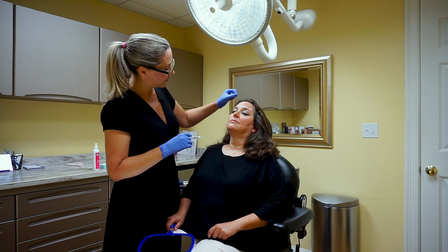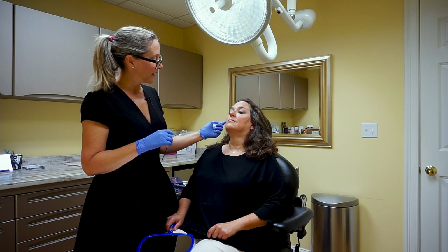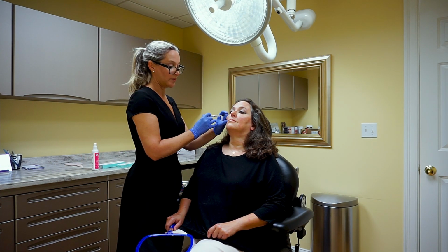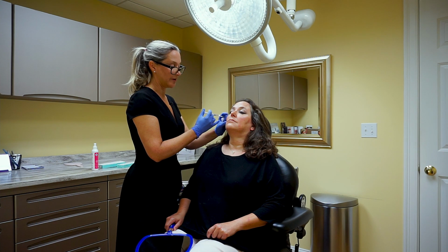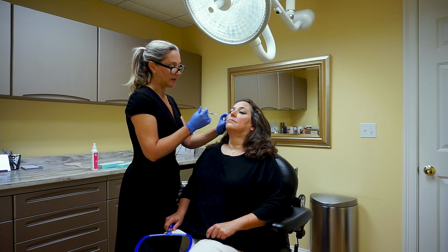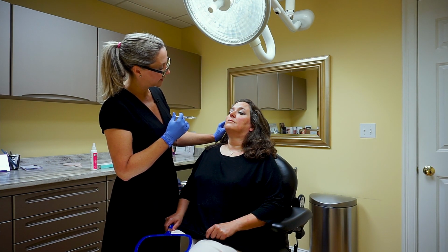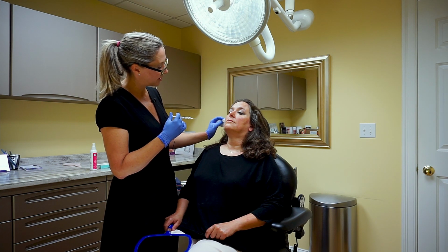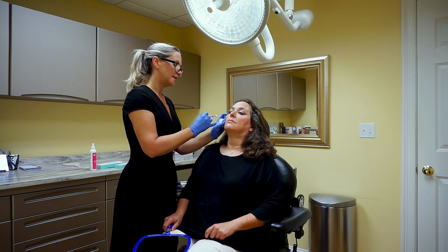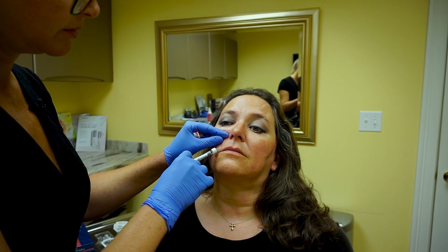But I've used about half a syringe, and you can see that we're starting to see an angular look here. You could take somebody who has a little more volume in their face, and actually by adding volume could make their face look thinner. And that's by balancing the way that you're injecting it and where you're putting it and the angles that you're creating and the shadows. So I'm creating a shadow out here. Gives me an easier correction.